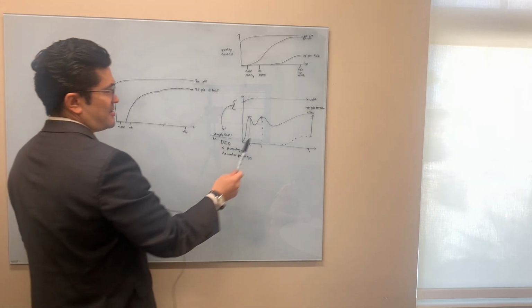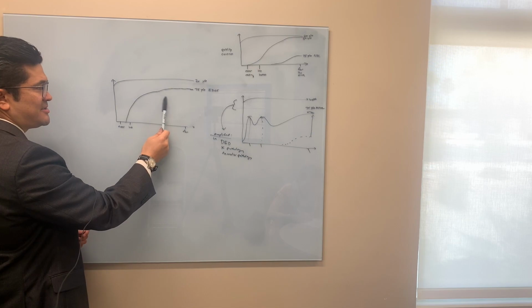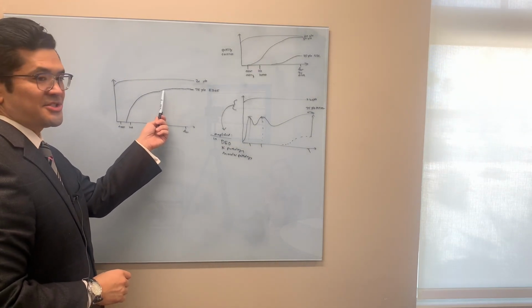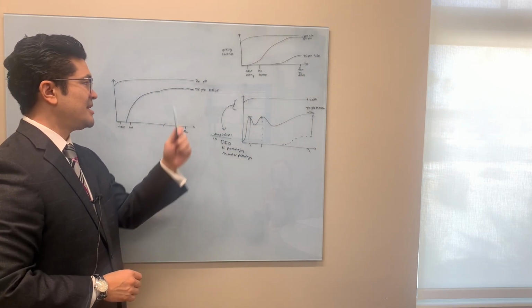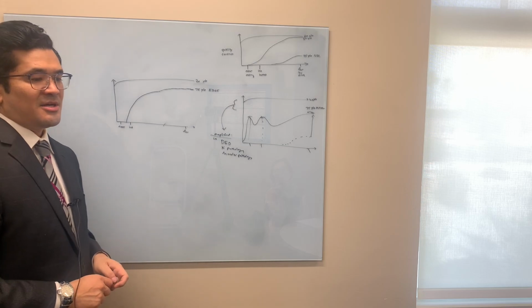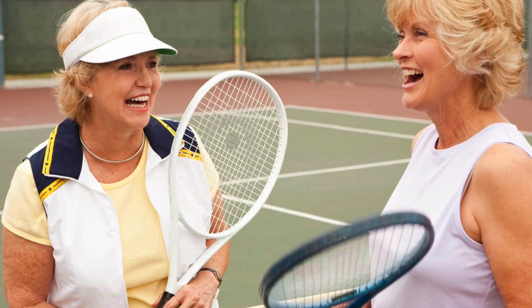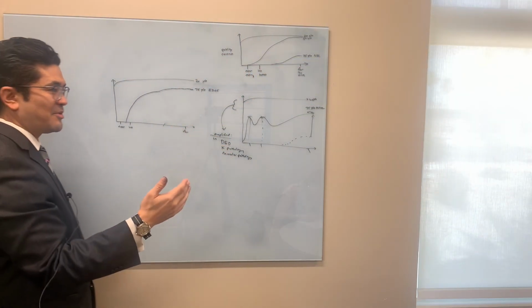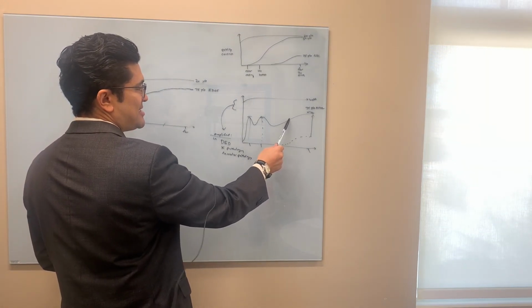So compared to the multifocal 75-year-old, they're going to have a little better vision in this range. That's why the people who love this EDOF lens, like Vivity, they're going to be the ones that are playing tennis or badminton or pickleball, because they can actually see the person across the court. They can see the person at the net too. Whereas someone with the multifocal, it would be a little hazy if they're up at the net.